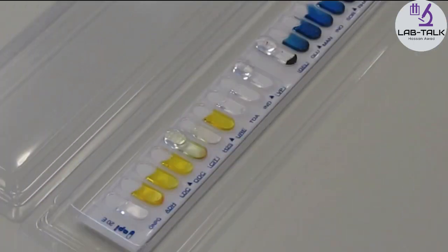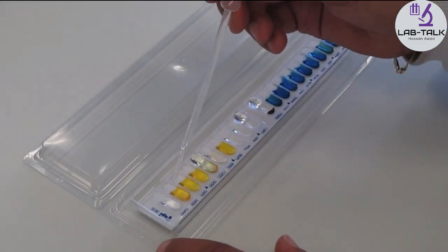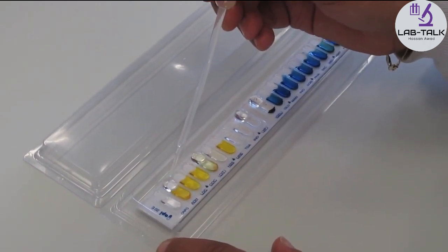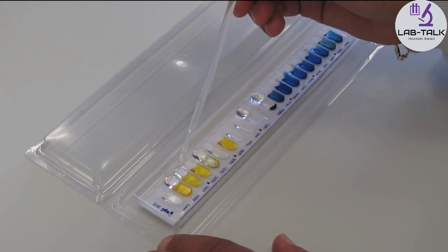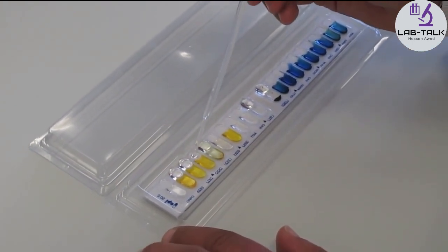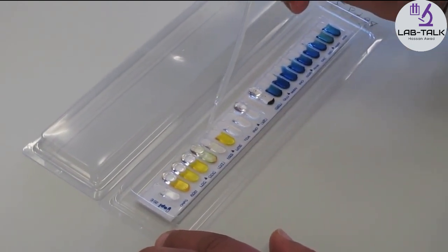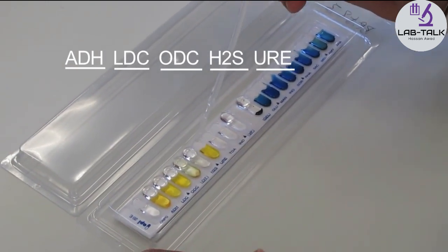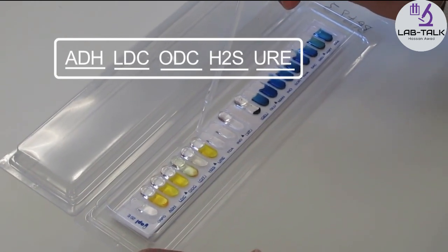Some of the tubes require oil added to the very top of the cupule. Usually liquid paraffin or mineral oil is used. The oil not only excludes air and introduces anaerobic conditions, but also stops gaseous products of certain reactions from being released. These gaseous substances would react with substances from adjacent tubes and affect the final results. These tubes are marked with a line underneath the names ADH, LDC, ODC, H2S and URE.